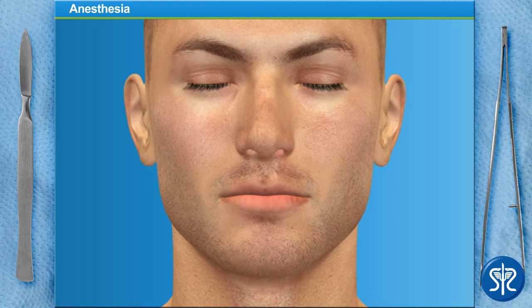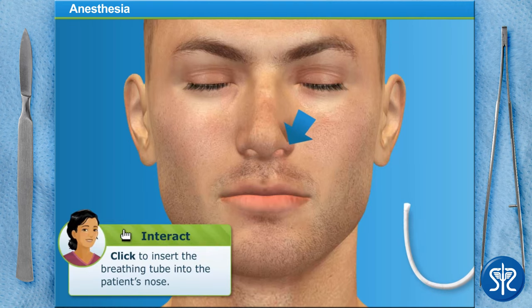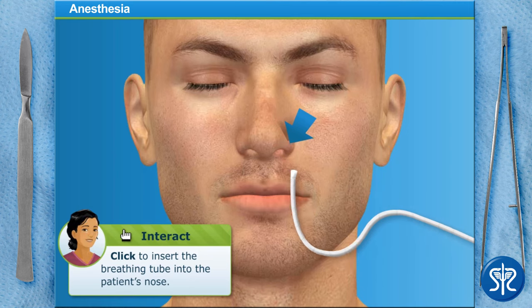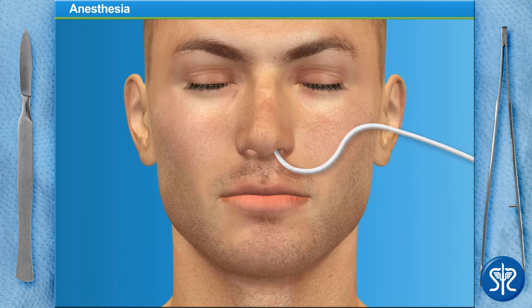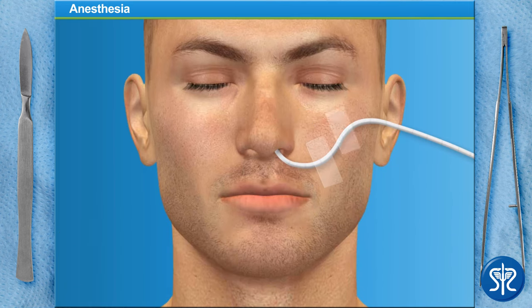One more thing. Since we'll be working in the patient's nose and mouth area, we'll need to make sure he can breathe. Let's insert a breathing tube into one nostril. Our patient is under and breathing. Now we're ready to remove the adenoids.